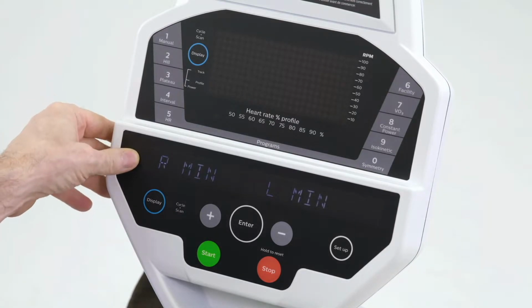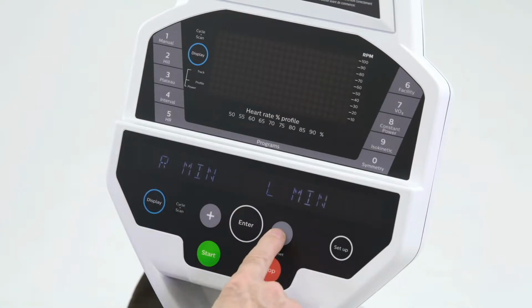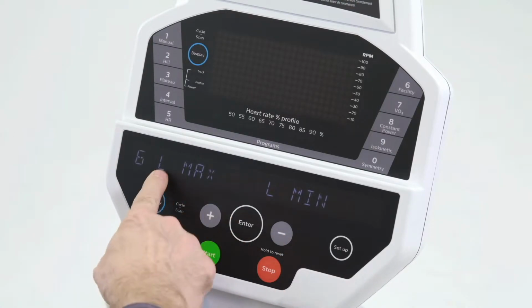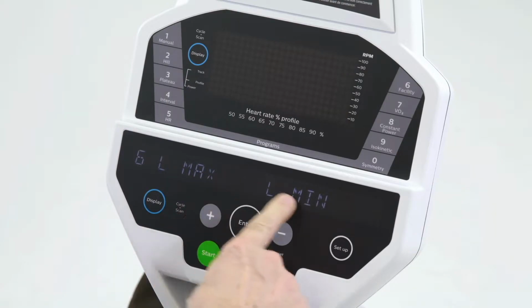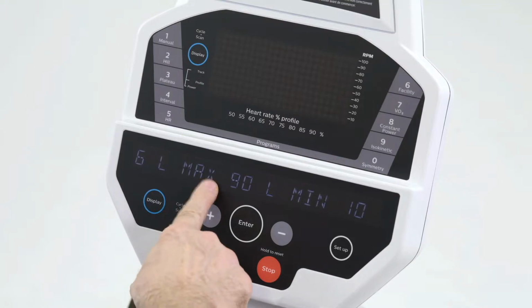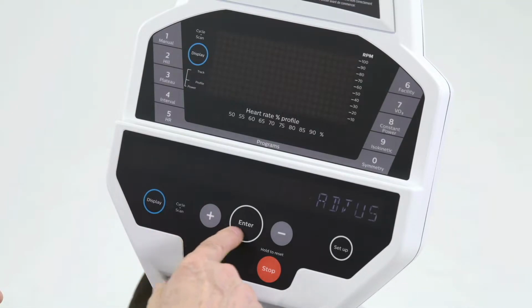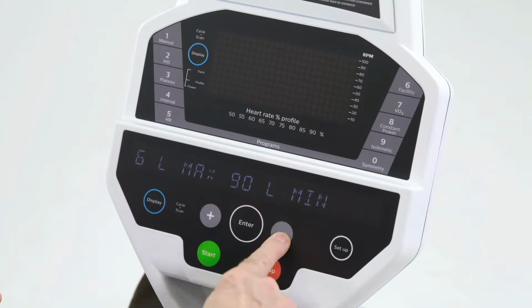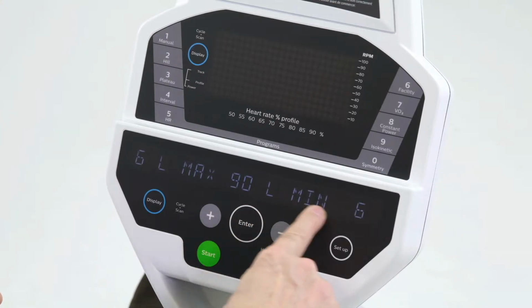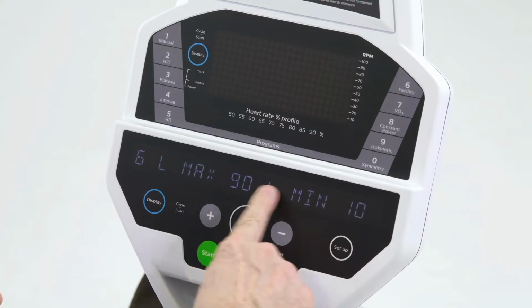We have 6 settings for the knee flexion. We have right minimum, left minimum flexion. We have all the way up to left knee maximum, left knee minimum. So we'll do that one. If your patient has a maximum flexion of 90 degrees, we can enter that, and then if their minimum flexion is about 10 degrees, we enter that.